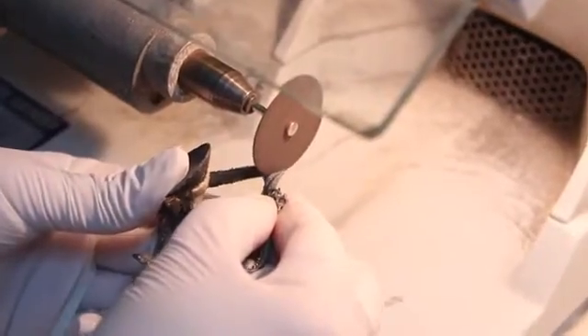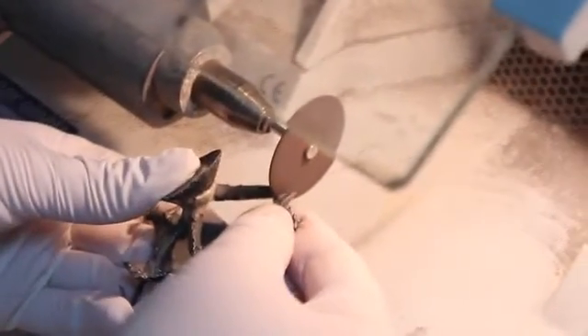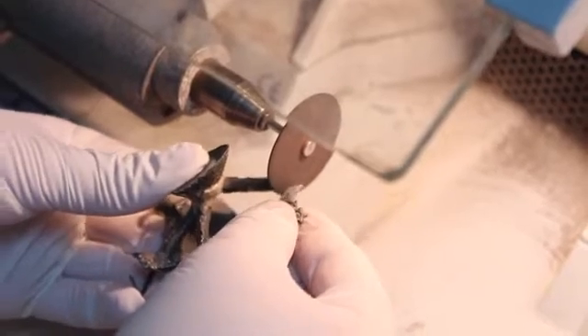The finishing procedure begins with sprue removal. Using high-speed lathes and large abrasive discs, the sprue leads are cut from the casting.